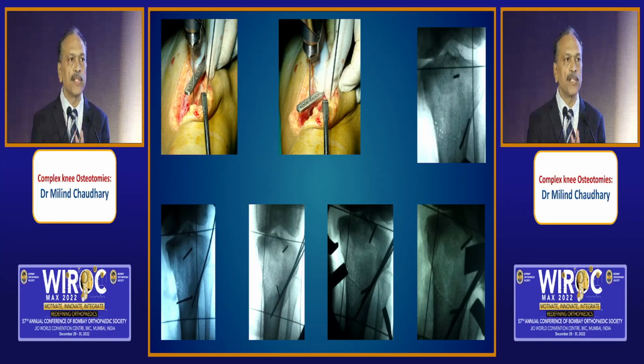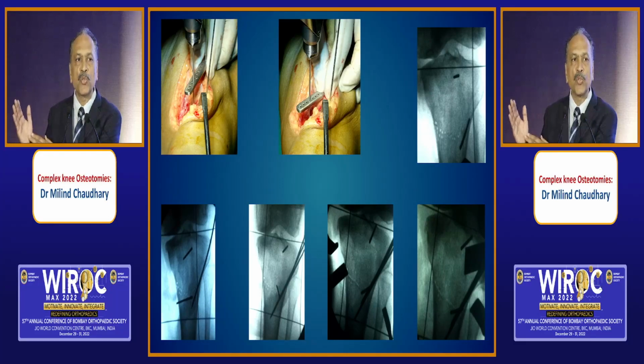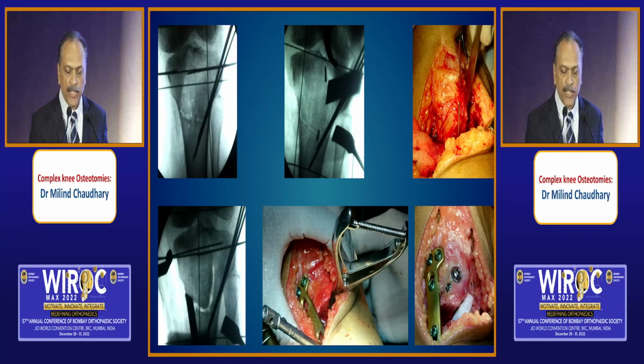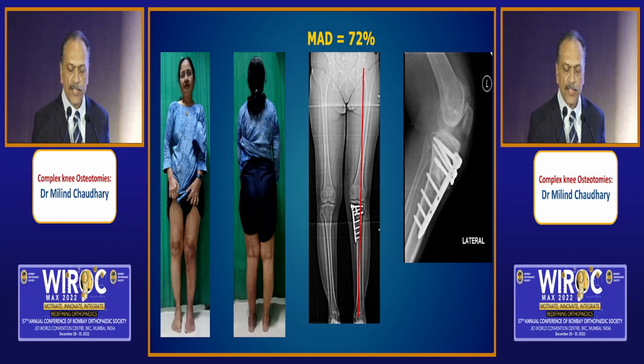The first vertical cut is outlined, then is the semicircular cut. You use these lateral cortex protection wires because you're too darn close to the lateral cortex. Yeah, with your heart in your mouth, you do this sometimes so that you don't fracture it, and then you create this osteotomy to give a good correction. No gross deviation of the joint line, as well as a good correction.